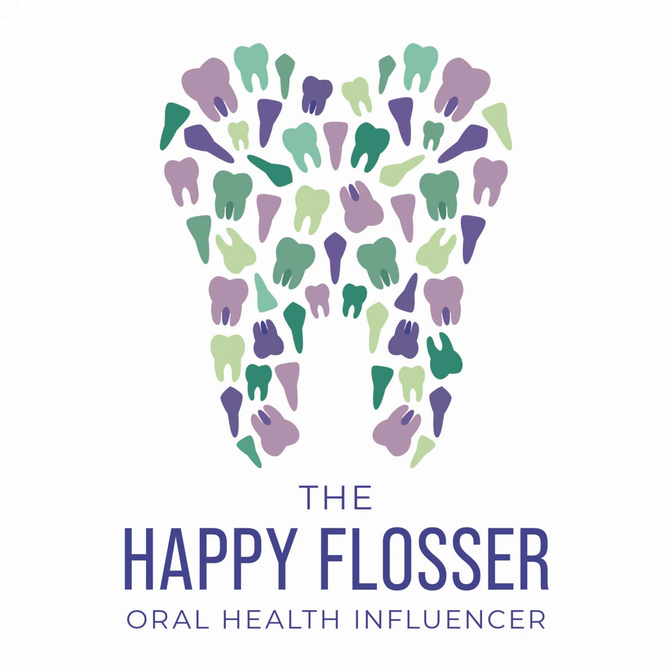For the bite wing radiographs, you want to make sure that the images obtain the distal of the canine and the posterior bite wing gets the distal of the second premolar and posterior. This will afford you the opportunity to see all the areas that you need to see when you are taking a full mouth series. I assure you this takes a lot of practice, and you will learn to critique your radiographs and make adjustments so that you obtain better quality images as you move along.